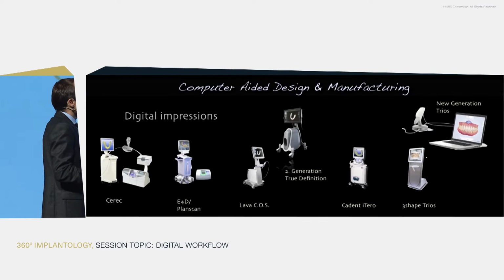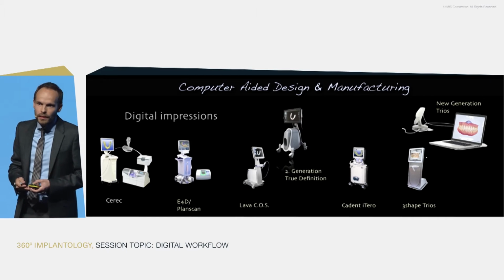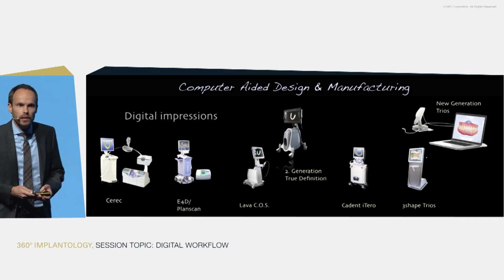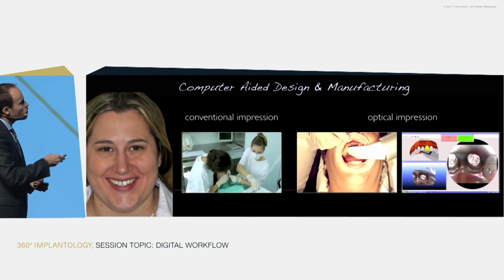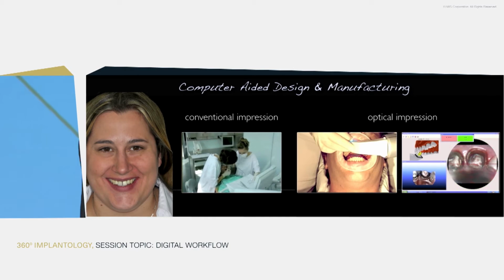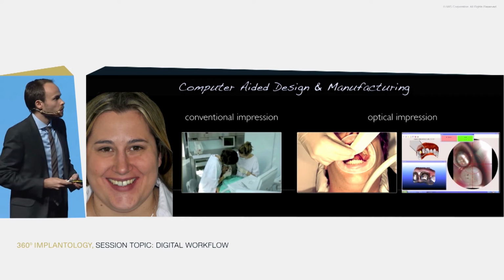Computer-aided design and manufacturing as a second topic, for sure, all starts with these intraoral scanning devices. This changes our lives, and especially your daily life in the office. What we see in the next two to three slides is a comparison of the two workflows that we used to work with, the optical workflow and the conventional workflow, with a very simple, straightforward case. Just two anterior teeth that we try to replace.